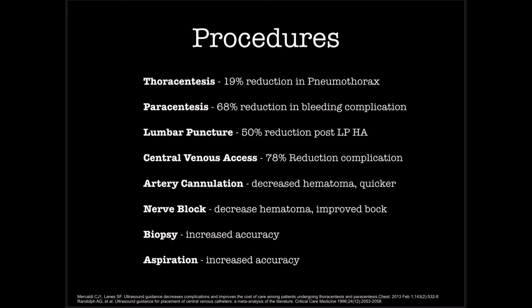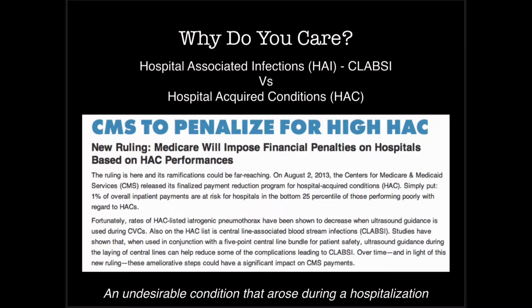And so we're going to focus a little bit today on vascular access because it's easier to give you the techniques we're trying to teach you. But all of these things that I'm teaching you are applicable to every procedure you'll do, whether it's a thoracentesis or a paracentesis, a joint aspiration or a joint injection, nerve blocks, biopsies, abscess drainage, it's all the same.